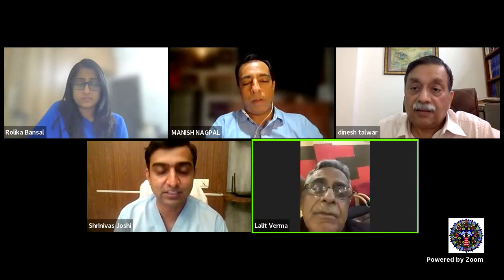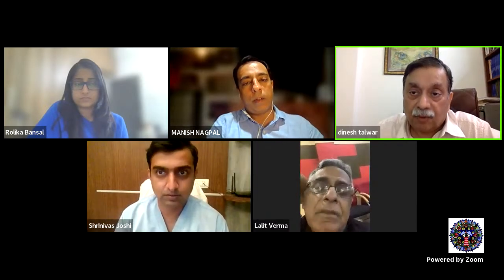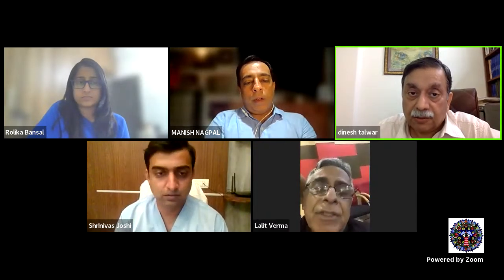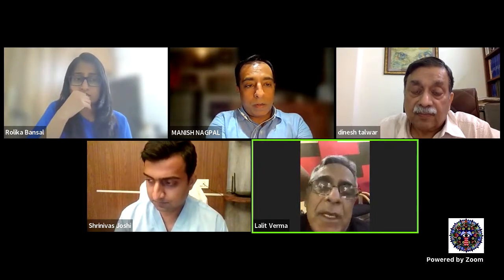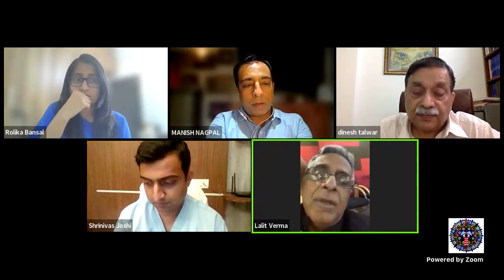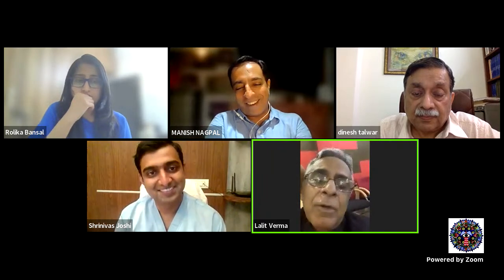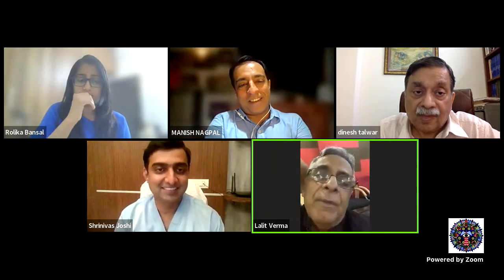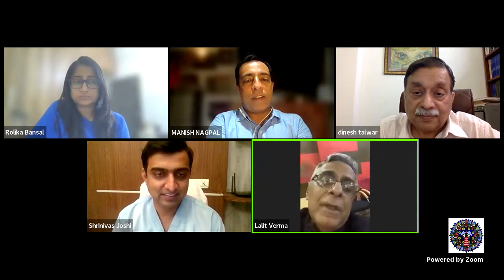Srinivas. Do we have any questions from the audience? Dinesh? Yeah. You see, this concept of leaving behind PFCL for inferior retina is becoming more and more popular nowadays. I agree. Initially, people used to have this inflammation, like Srinivas was saying. But I think a lot of people are doing this procedure now.